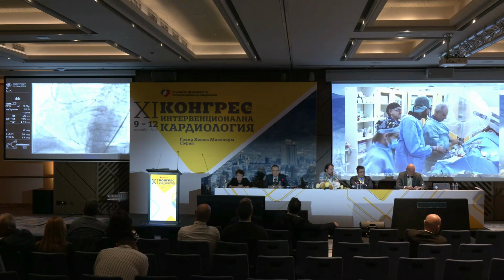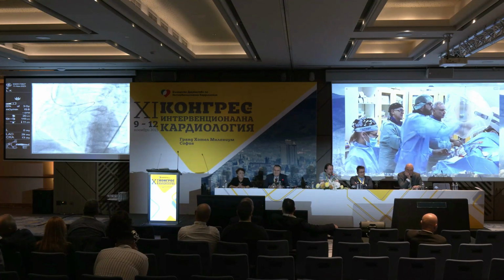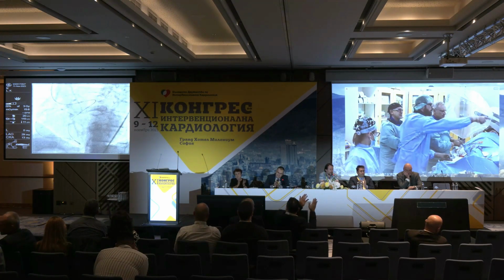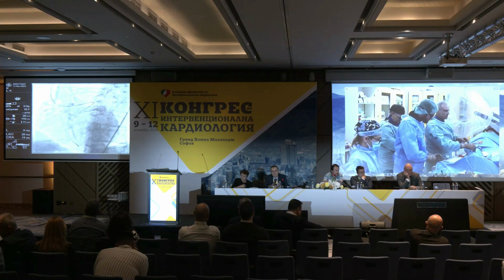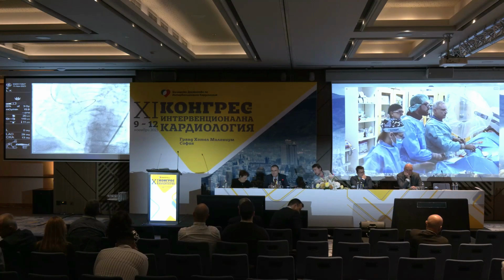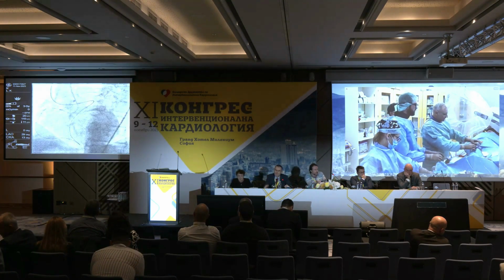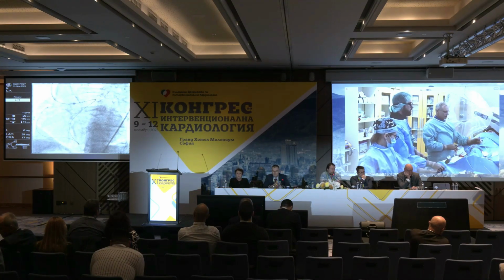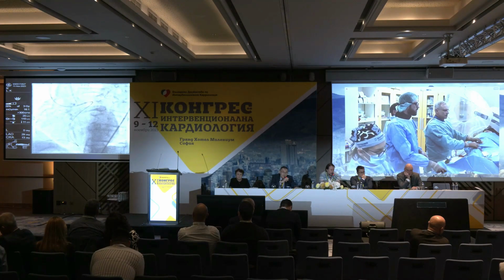But thank you very much for this nice demonstration. It was masterly done as always, so thank you very much. So the case is almost done here. We have some more aspects. I don't know if you have more. You see the balloon there, it's inflated. And over this balloon now I'm going to advance. I've essentially run out of microcatheter completely. So I will just push the guiding catheter in antegrade.